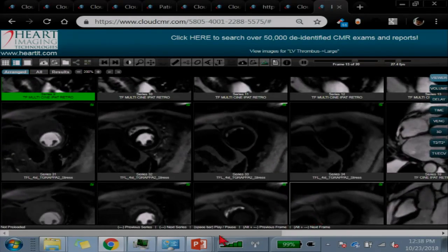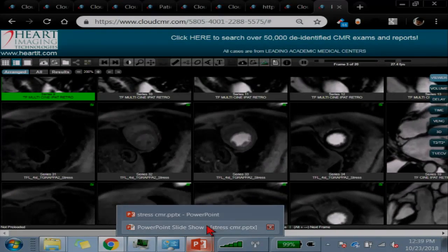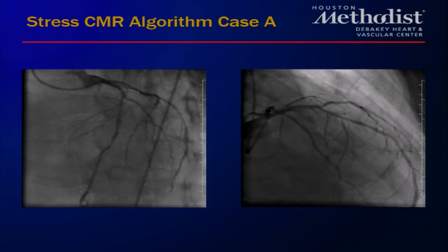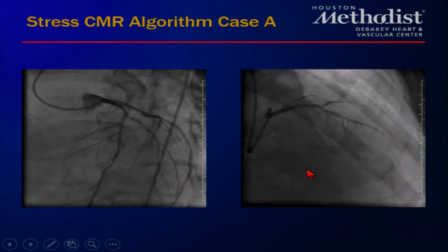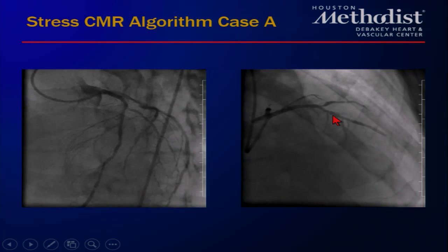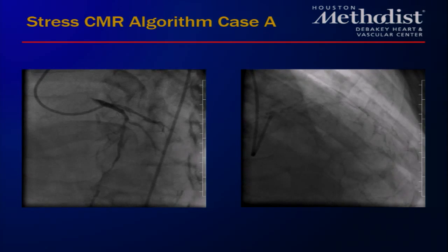But this is a corresponding angiogram, and there's a suspicious lesion up here, but it's not the most obvious possible diag. Okay.